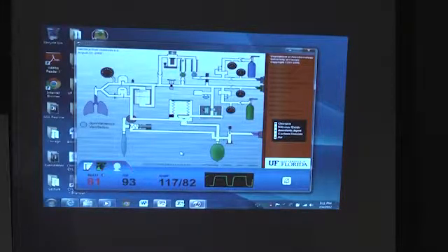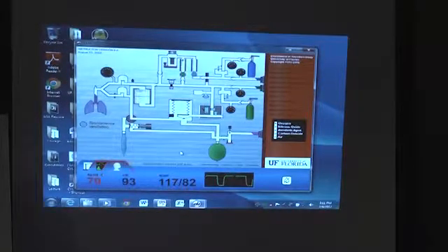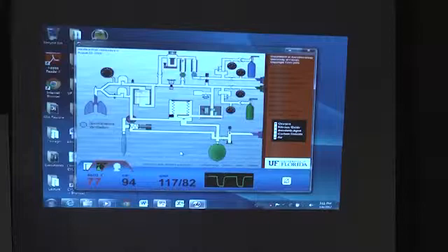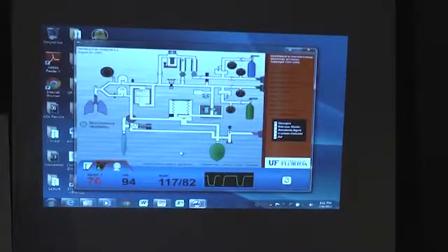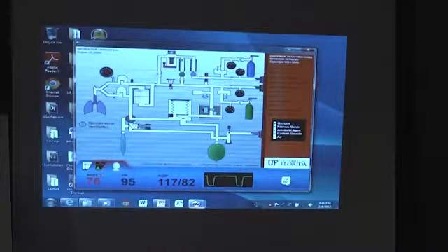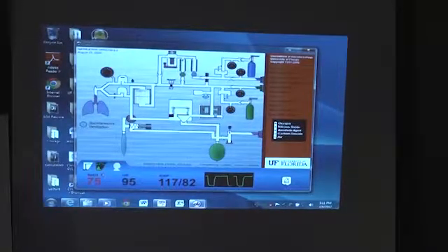I would turn off the pipeline and turn on the cylinder. That's the right answer, because remember the troubleshooting. You call for help, and you take an Ambu bag, not the bag on the machine, an Ambu bag, and you ventilate the patient. When you do that, the saturation gets better. What does that tell you? That it was the machine.